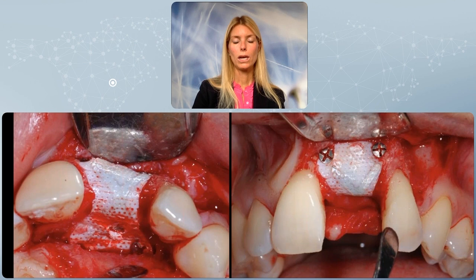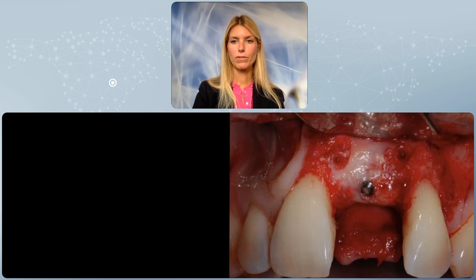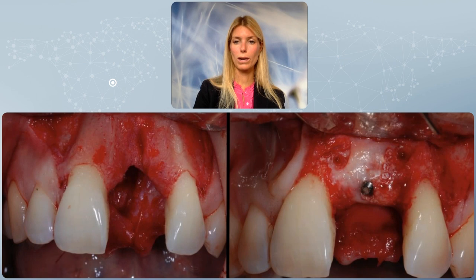This is the only downside. However, we need to position our implants. So in fact, it's only one surgery where the titanium reinforced barrier membrane is removed, and we can see the volume of bone achieved in the area, which is very significant. You can immediately notice the head of the tenting screw, the umbrella pole that we've positioned.